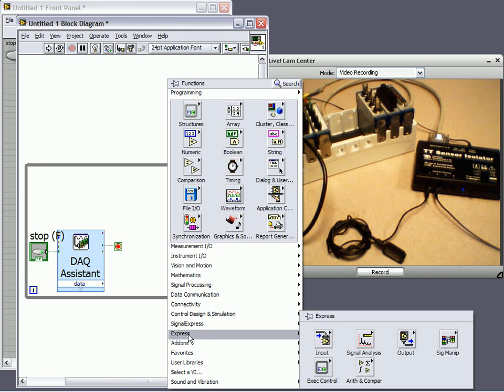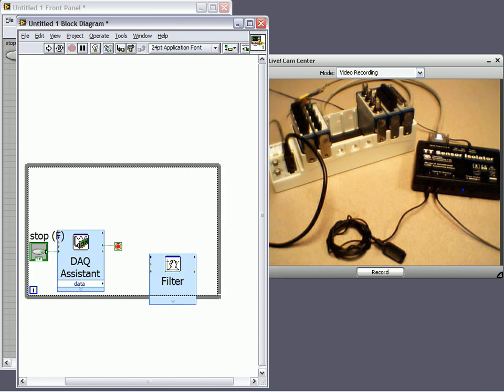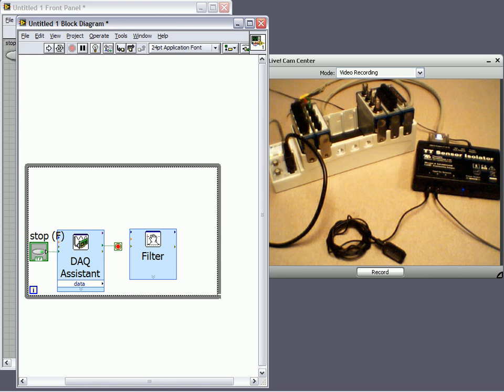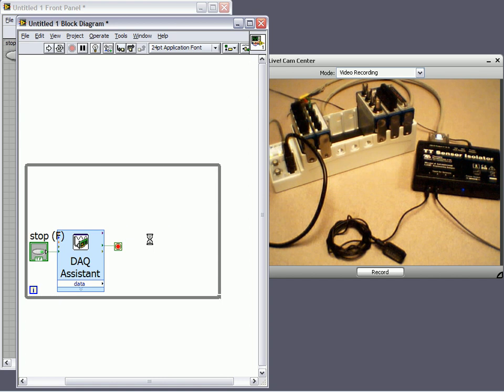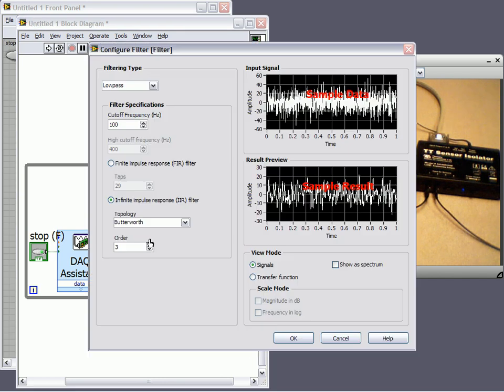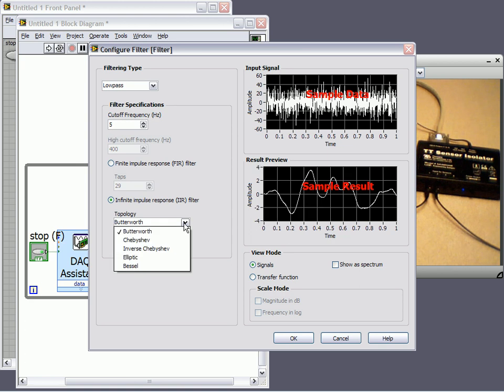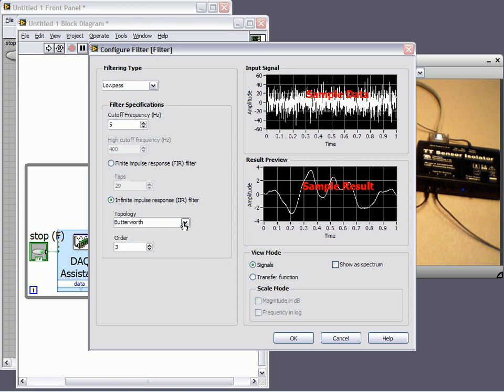The next thing I'd like to do is perform some type of signal analysis or processing. In this case, I'd like to filter high frequency components, anything above 5 hertz. I'm acquiring my heart rate and my respiration rate, which I don't expect to be faster than about 2 or 3 hertz, if that, so I'm going to use a low pass filter with a cutoff frequency of 5. You can select a different type of filter if you'd like, and then click OK.